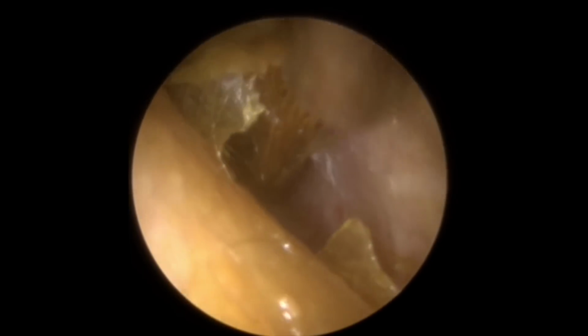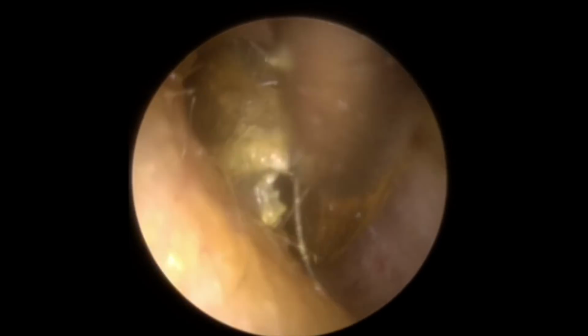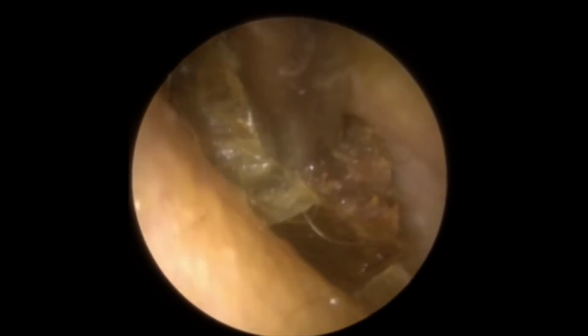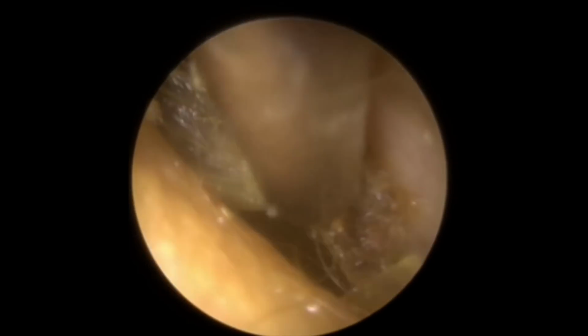I saw that on YouTube the other day. And as you can see, we're trying to get a hold of this deeper piece of wax, but there's a flap of skin that keeps coming down in the way. So as we get a grip on it, the suction is pulling that piece of skin in, which is stopping us from getting a good grip on this chunk of wax here. So we need to try and work this out while we're just wrestling with this.